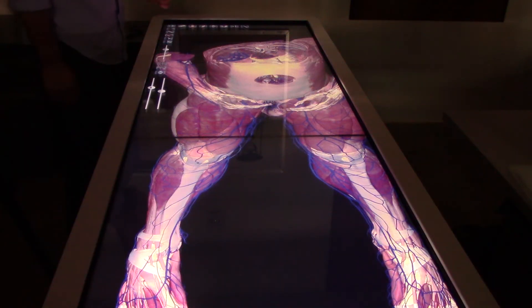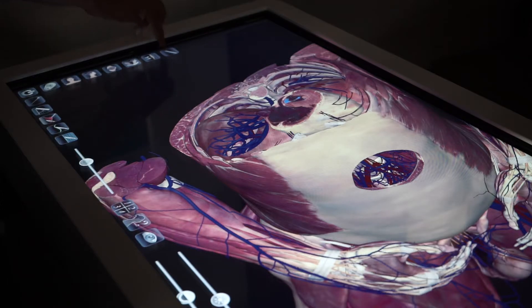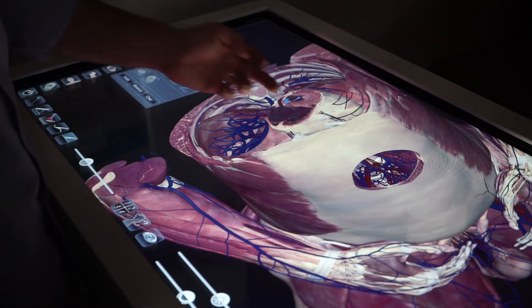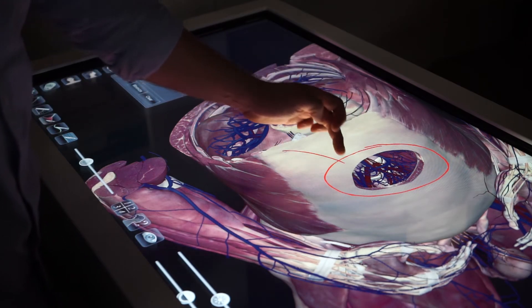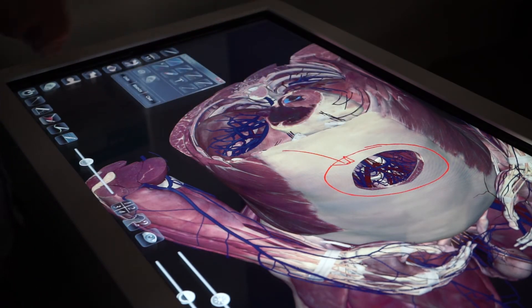You might also choose to annotate on top of the body, which you can do by selecting the pen tool, picking a color, then drawing on the table to indicate or identify certain areas you'd like to highlight.